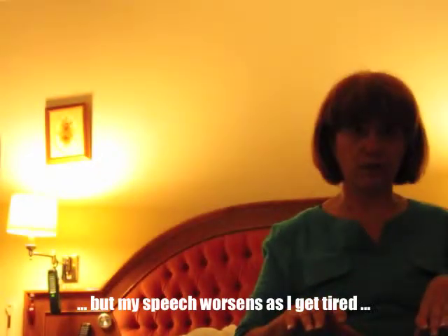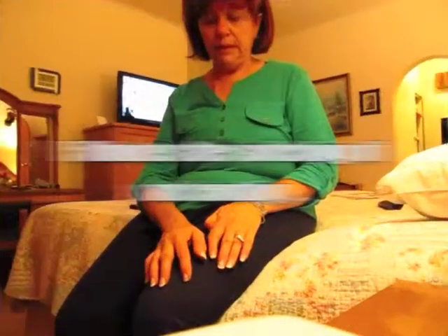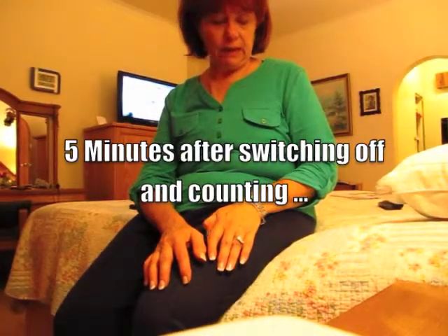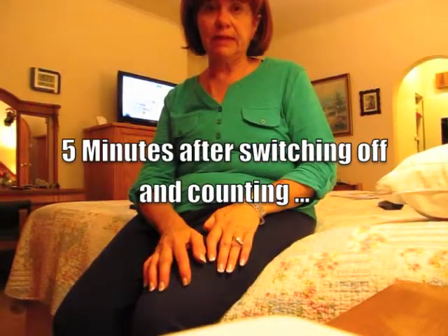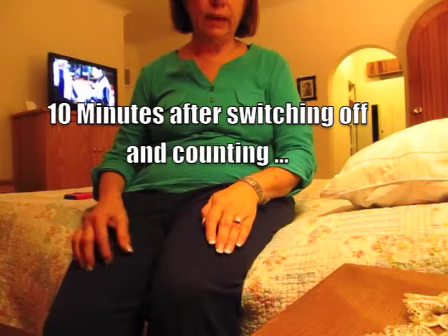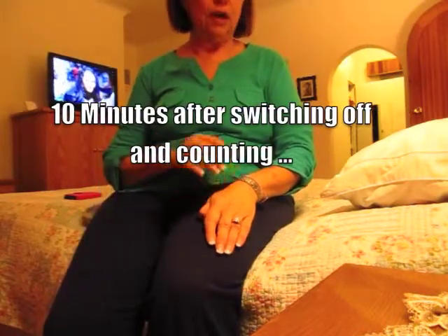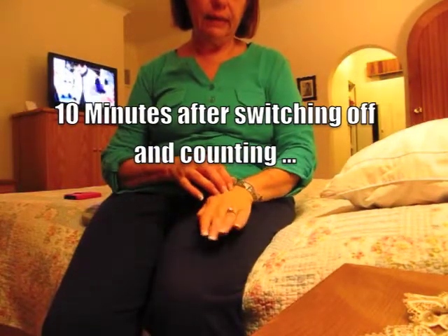I'm going to leave it off for, let's say, 10 minutes, and then switch it on again and we'll see. It's still switched off — I haven't switched it on yet. It's been about five minutes. I'll wait another five and see. My left side is my weaker side — the shaking started on the left side — and now it's completely still.